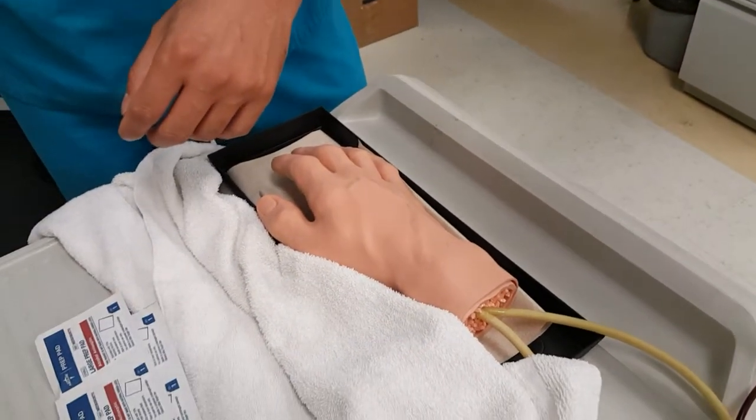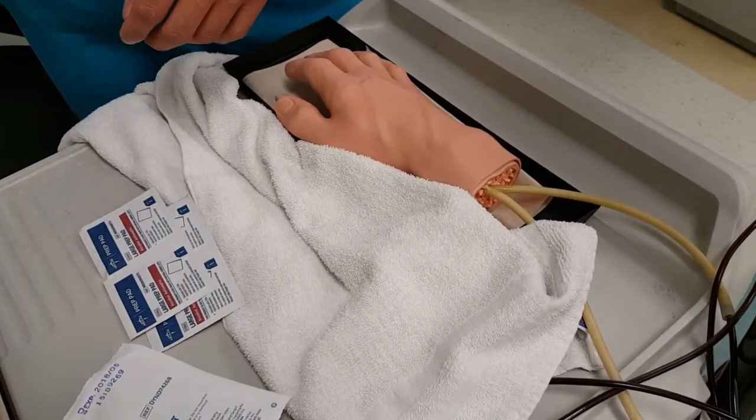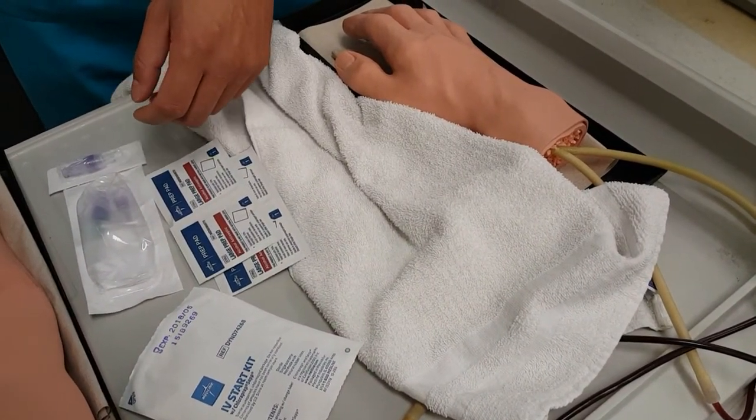Get your alcohol pads. Get your IV start kit if you have one. Then get your tubing and your IV.